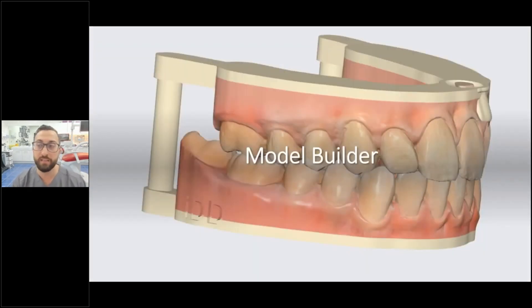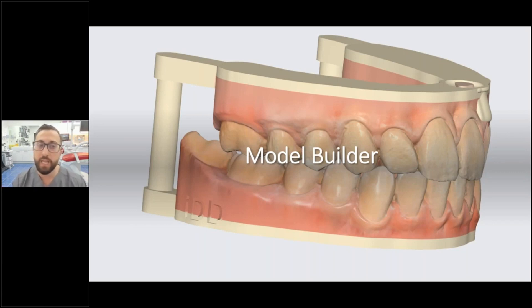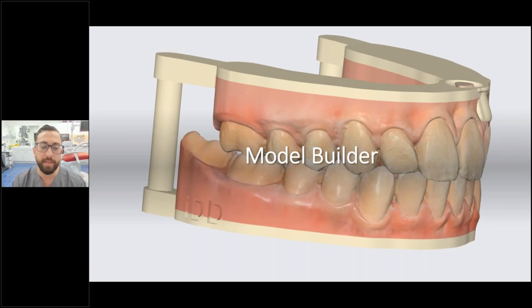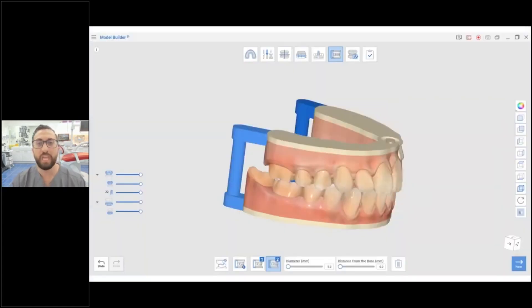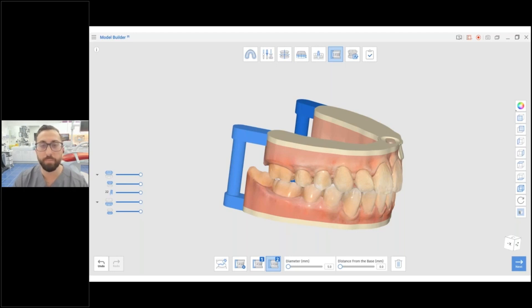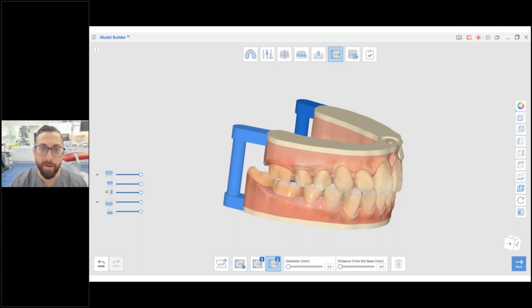Medit Model Builder is probably the best model builder on the entire market. Three Shape has a nice model builder, but it just doesn't have the same functionality. Previously, we used to make models using Meshmixer, which was such an annoying process. Now with the Medit Model Builder, you can literally delegate this to your DA — it's so easy and efficient, ready within just a few clicks.